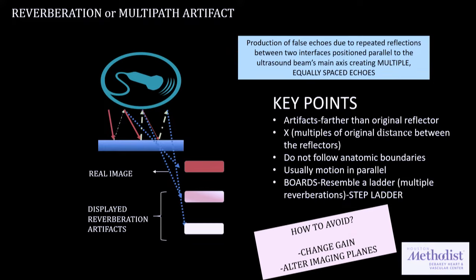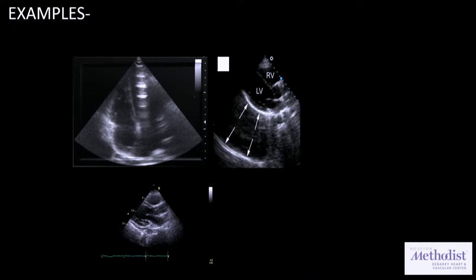How do you avoid these? That's more important, right? Obviously you change the imaging plane, you change the gain, and you can also change the TGC if you want to. So all that can help.